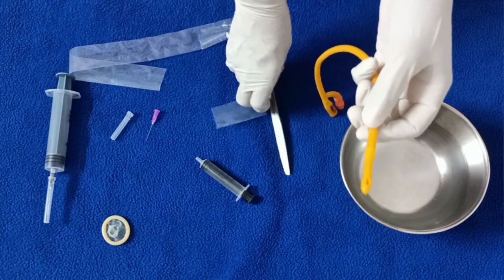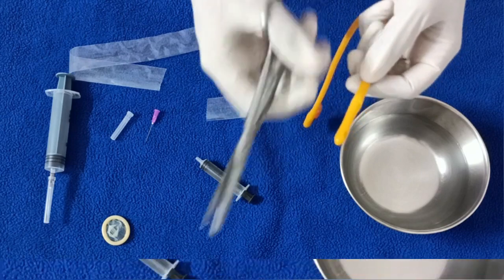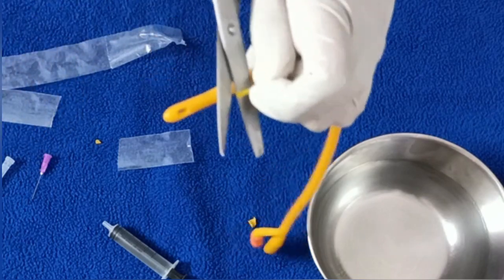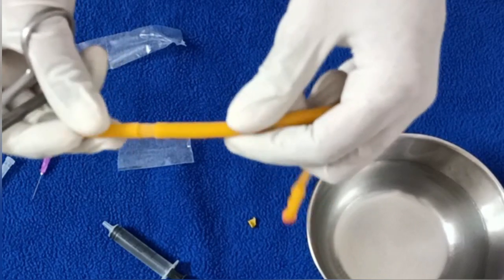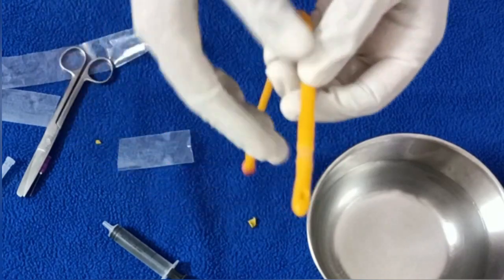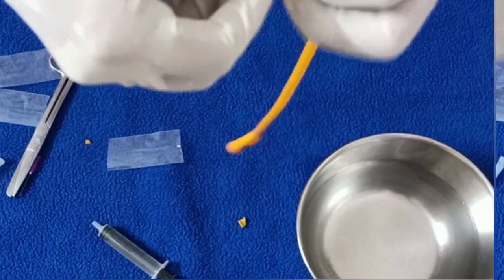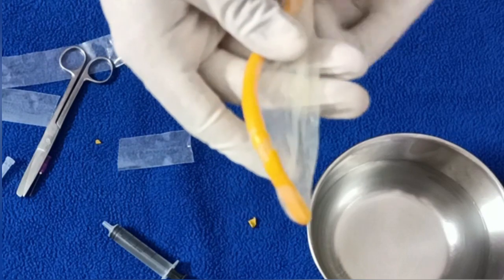The balloon gets punctured and now we excise the area of this balloon. I have excised all around the balloon. The next step is to roll the condom over the catheter. Now we have put our condom over the catheter.